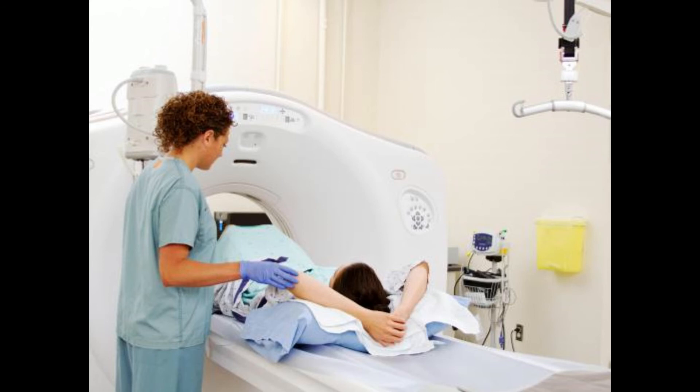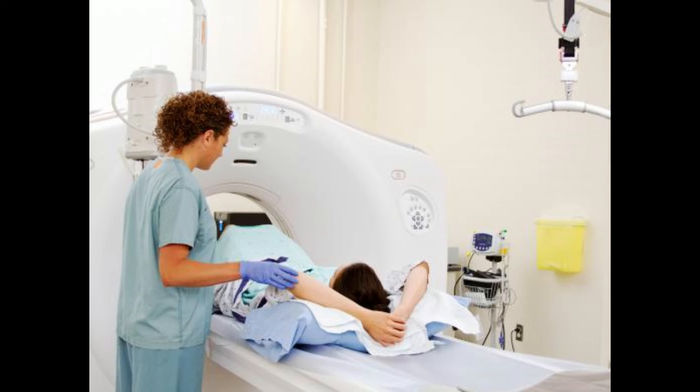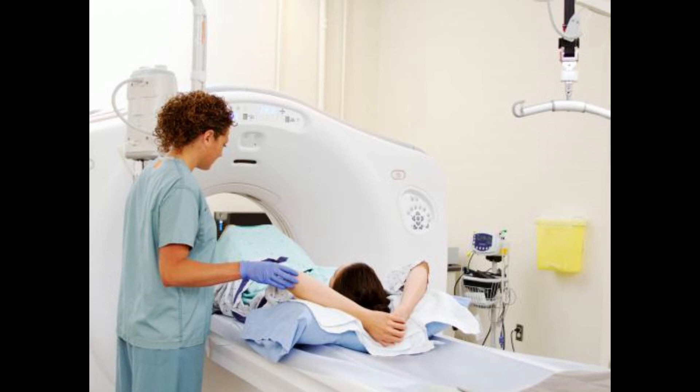After a period of about an hour, the doctor then asks the patient to lie down on the scanning table. By this time, the radioactive glucose will have made its way into the cells that want it most. Radioactive molecules, like FDG glucose, are inherently unstable and break down by emitting particles that contain energy.